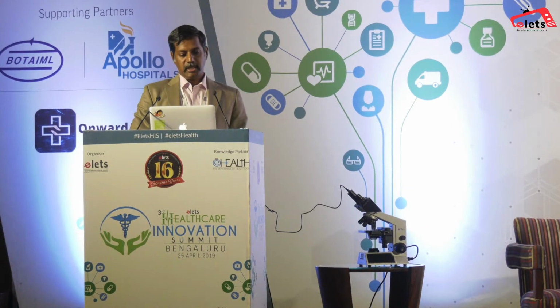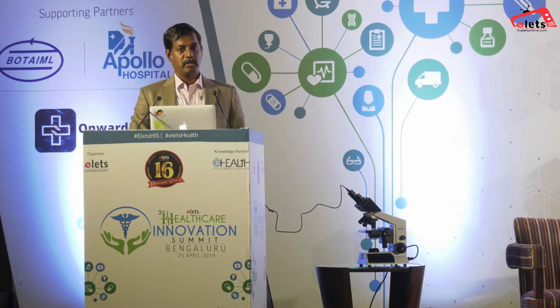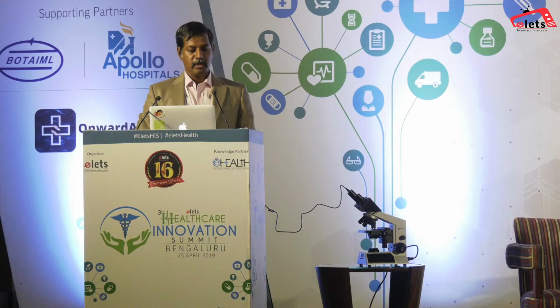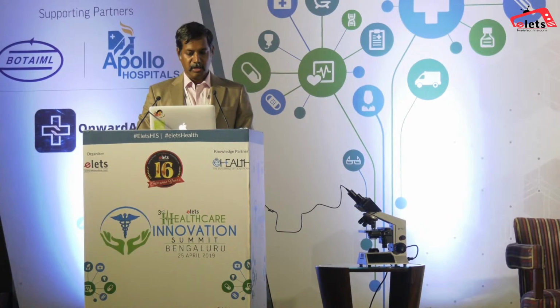So in this case, I'm a pathologist. I could just log in wherever I am and start seeing these images. At the same time, I could also request what is called a live stream, right? Suppose I have these slides. I could go in here and see these images and start entering a report. These report templates are standard. I could do different types of annotations provided I see something interesting, right?